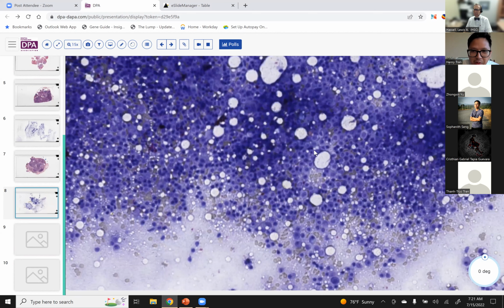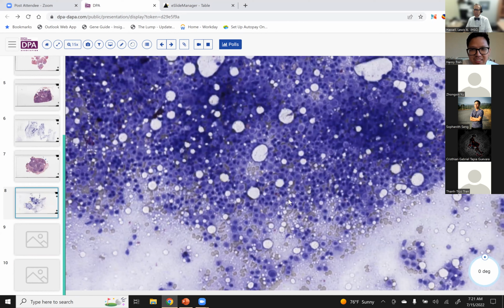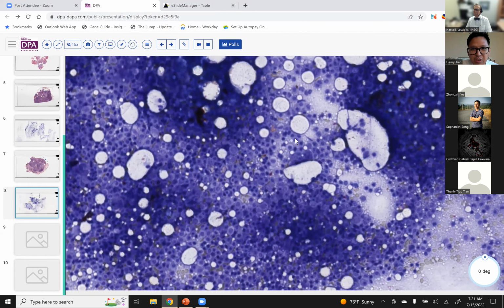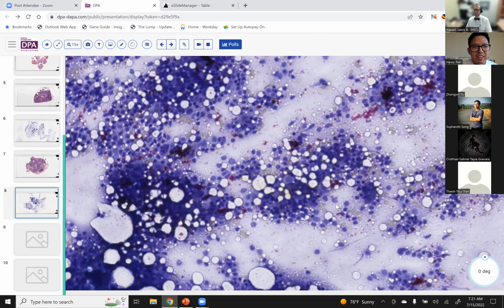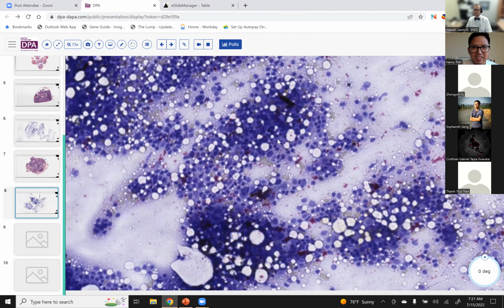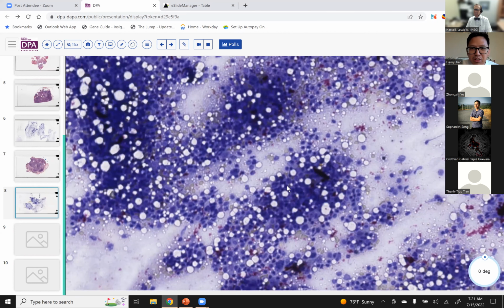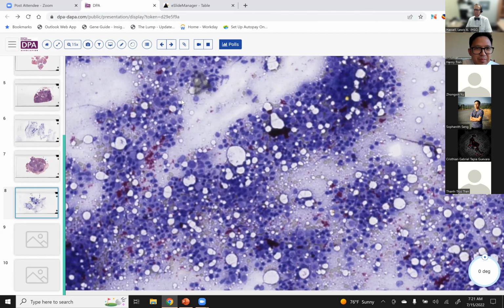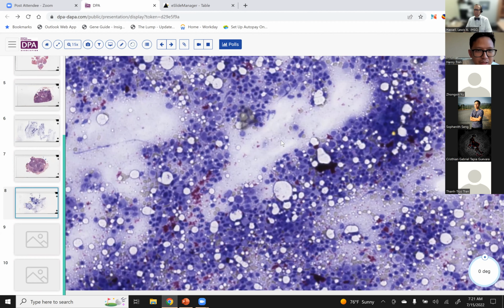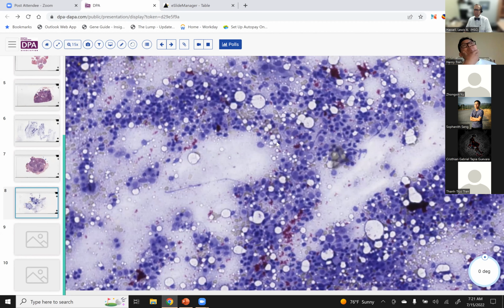What I'm seeing now is not those ovoid lesional cells anymore, but a lot of just normal-looking lymphoid tissue. And I thought to myself, oh, what the heck? What happened to all those spindle cells? I thought maybe this could represent some sort of metastasis to the lymph node, or maybe this was the lymph node, but this lymphoid tissue is the primary lesion.